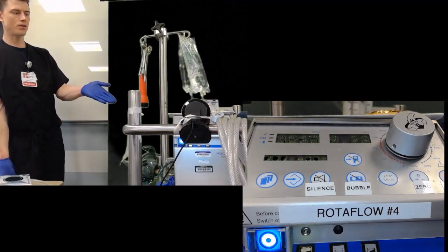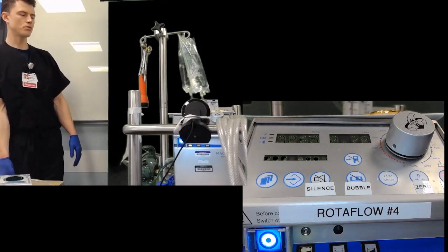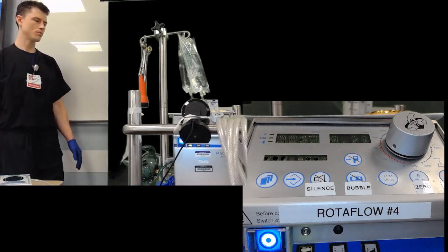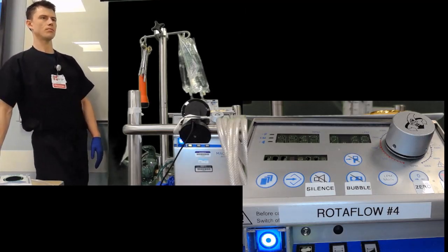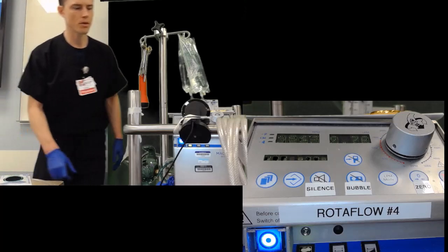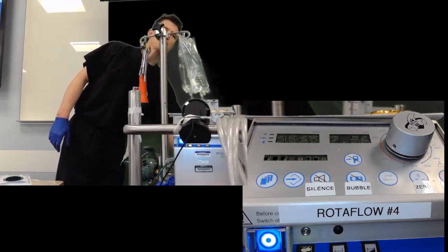So there's a dial on there, right? So FiO2, you're going to 100%. Okay, so you did that and nothing changed. You said also the blood flow. So okay, so blood flow, right? So we wanted to make sure the blood flow is okay, so we fixed our kink and our blood flow was, let's say it was okay.